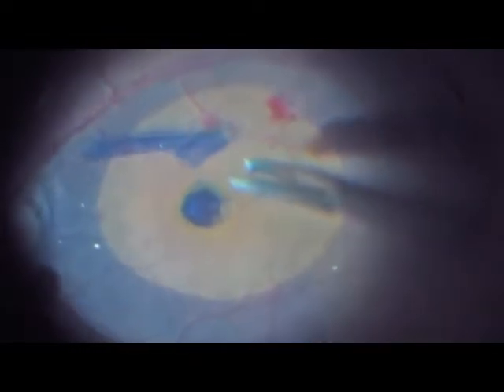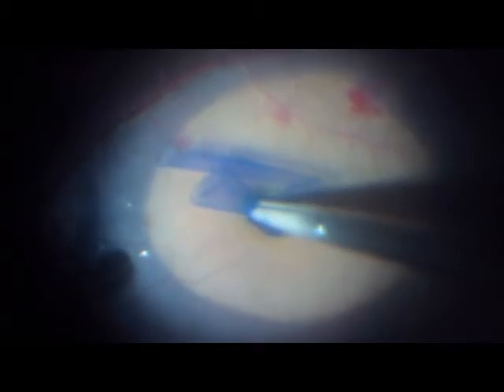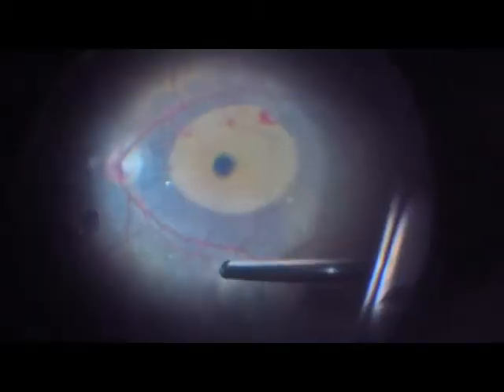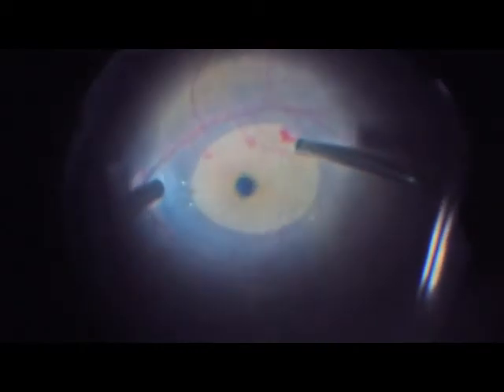We now use the closed tip of the ILM forceps to actually move the ILM into the hole in a very slow and gentle fashion. We go downstream from nasal to temporal towards the hole. Since the hole is a large one, the tip will fit in without a problem. You can see the membrane rolled over itself in a tubular fashion, which makes it easier to enter the hole.